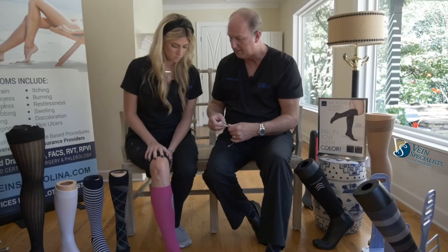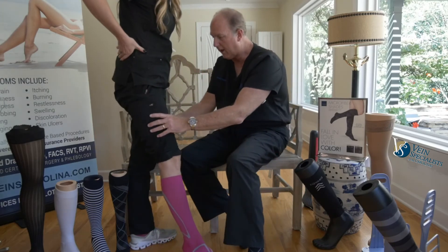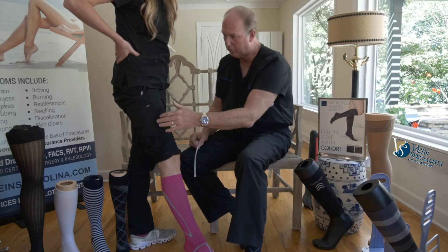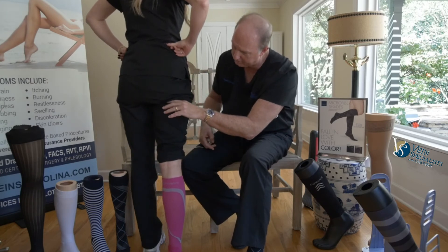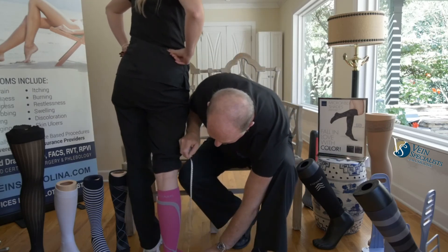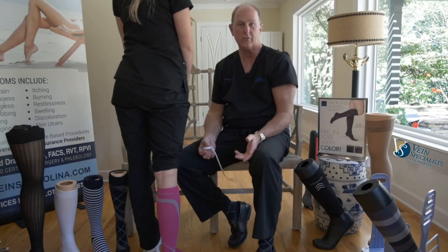For the thigh-high garment, the difference is you come up to the middle of the thigh and measure the circumference there. Then, to know the length of the thigh garment, you go to the crease of the buttock and the leg and measure that distance with your foot flat on the floor. That determines what length you'd use for the thigh.